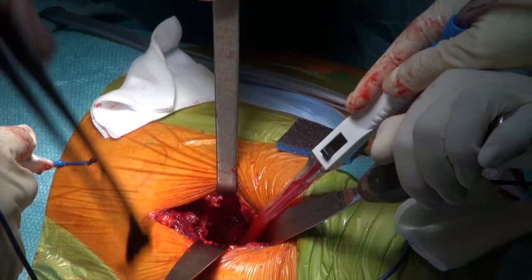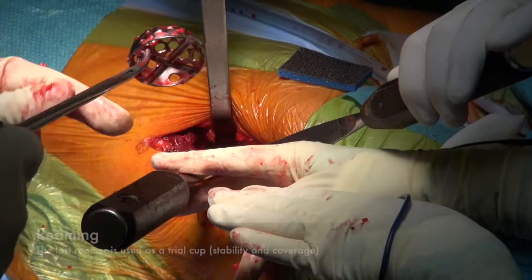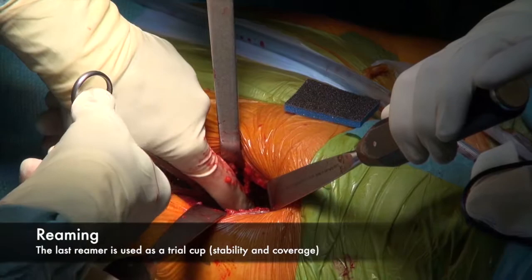Inclination should be more than 45 degrees with respect to the table's border, near 60 degrees. Antiversion, nearly 20 degrees, depending on each case. Sufficient reaming is important to get optimal stability with the RM Pressfit Vitamys cup. The last reamer is used as a trial cup for stability and coverage.